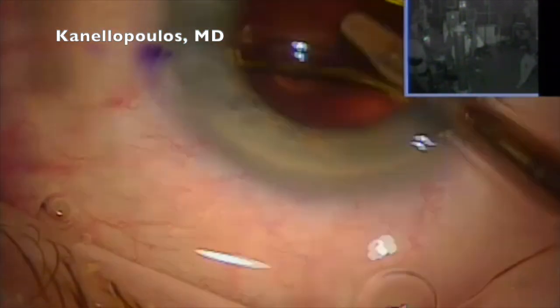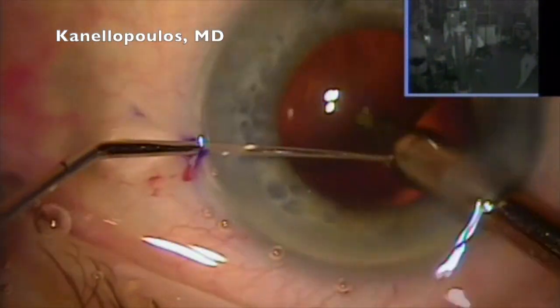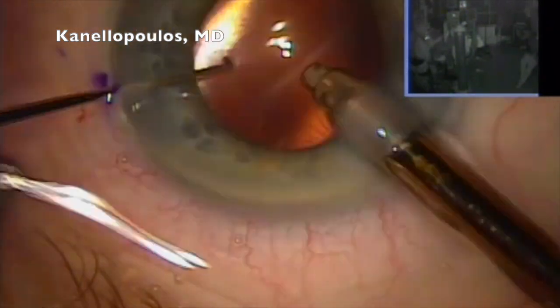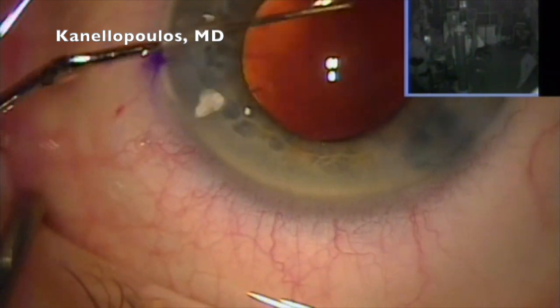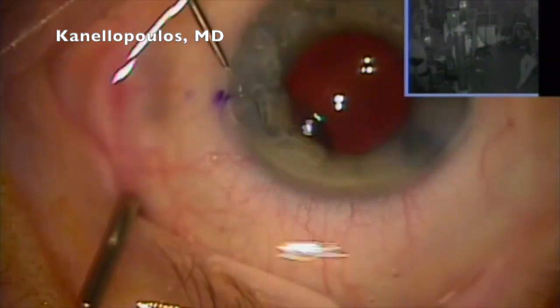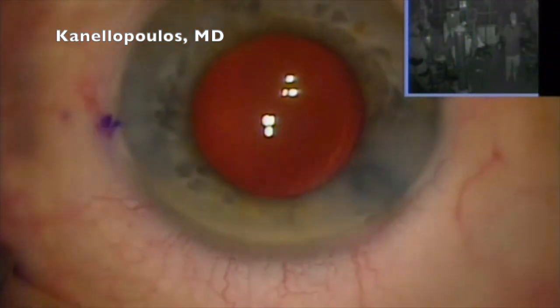So this patient is going to be up for a big surprise from barely count fingers to why not, if the macula is as it looks at OCT, perfect, she may reach 20/20 or even better visual acuity. Everybody deserves it, even in your 80s. That's our philosophy. We don't consider these premium surgeries. These, as you can see, are routine surgeries, watertight.